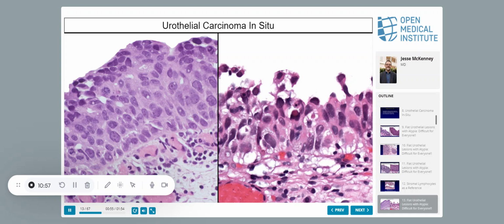What's that? Your previous slide says "does not always have high NC ratio." So it's not obligatory to have big nuclei? No. The issue is they will always have big nuclei, but sometimes they still have a lot of cytoplasm. So it's not that the nucleus is small. It's that they still have pink cytoplasm. Nuclei are always big. Now I'll show you one variant where they're not quite so big, but they're still big. But that's the harder cases, okay?